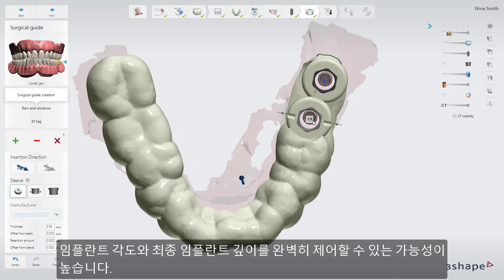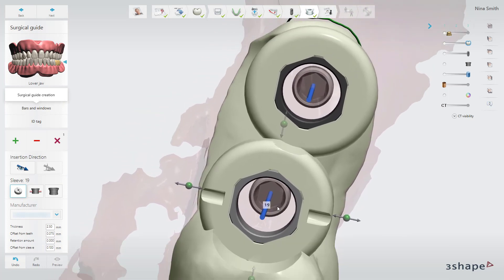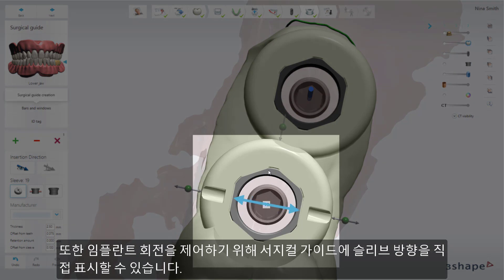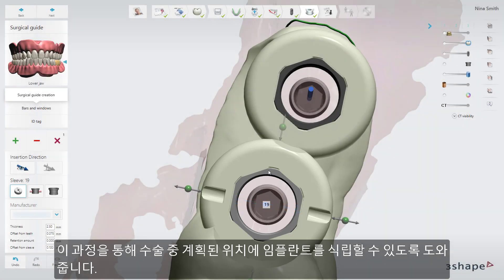It has great possibilities for full control of implant angulation and final implant depth. When using a guide, you can also place sleeve orientation marks directly on the surgical guide to control the implant rotation. This will help you achieve the planned implant connection position during the surgery.